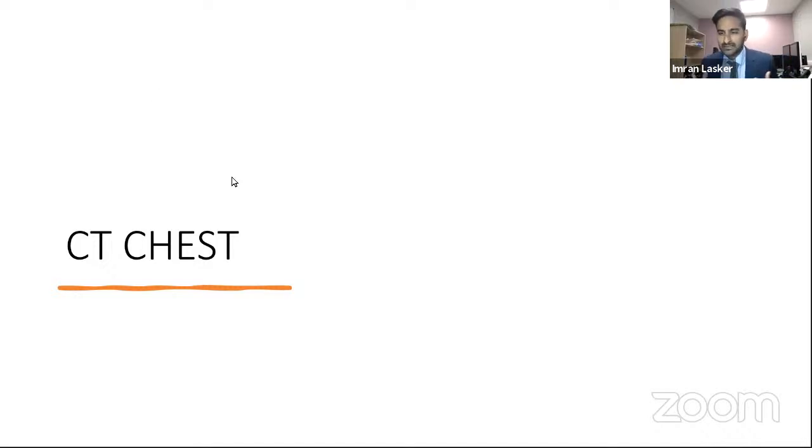Now, how many CT scans exist in the realms of CT chest? Because for you guys, asking for a CT chest is asking for a CT chest. You come and say to me, Dr. Lasker, I've got a patient with chest pain, I need a CT chest. And then you've got to start thinking about what a CT chest means to me.